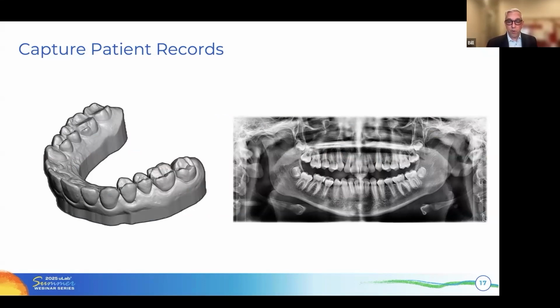You're probably taking more photos, maybe a CBCT. I personally take intraoral scan to capture STLs, intraoral and extraoral photographs, a CBCT, and a pano before my consultation. So when a patient says, I'm ready to go, I have everything I need right there. But these are the two very basic things that you must have. Yeah, must. It's tough to use that word, but must have to effectively do a digital indirect bonding because you really want to know where those roots are to be able to effectively do this.